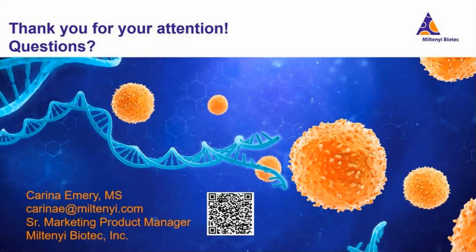Will the Miltenyi dissociation kits work with transcriptional inhibitors? This is not something we have tested internally, but we've seen several publications where people are adding transcriptional inhibitors to our enzyme digestion mix for the dissociation step, which is typically performed at 37 degrees, and have found that to help prevent dissociation-induced gene activation.